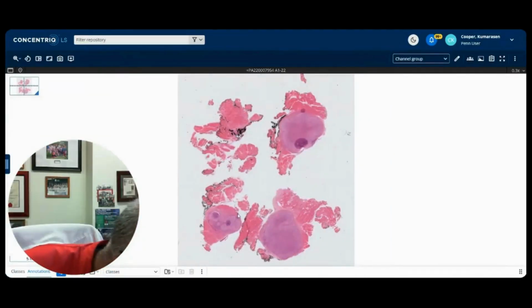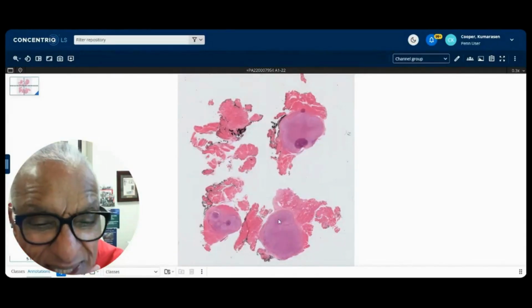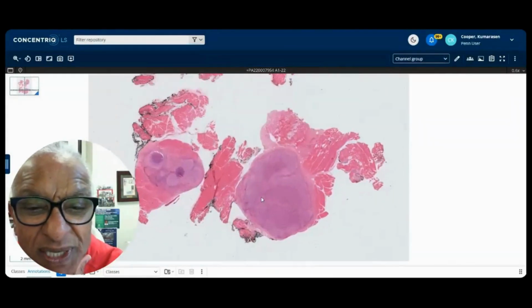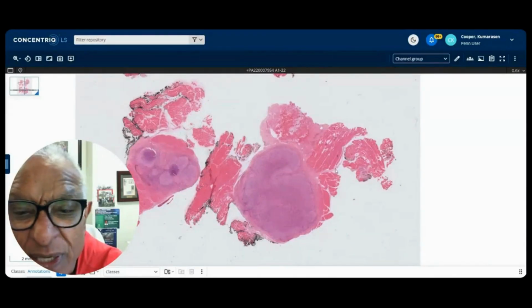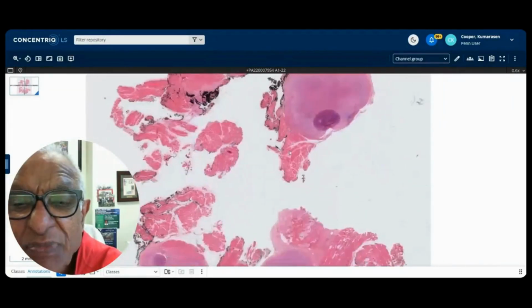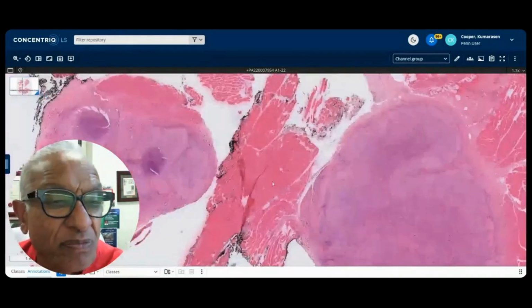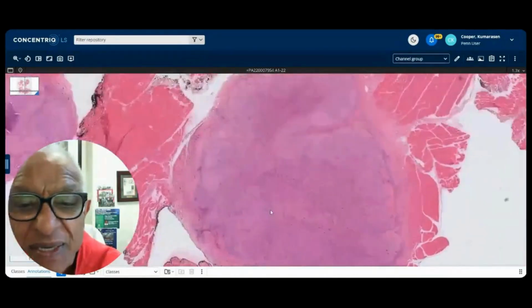So this is a nodule. This is a neck mass. The neck mass, 43 male neck mass. There's some artifacts there, so I'm just going to go for this nodule here. But you can see that this was shelled out by the surgeon with a little bit of skeletal muscle. So it's pretty deep. Okay, it's deep. And I'm just going to show you the skeletal muscle around there. Yeah, that's just a staining artifact.